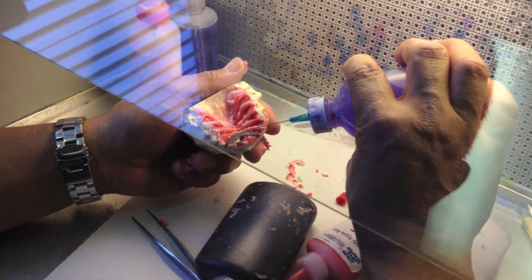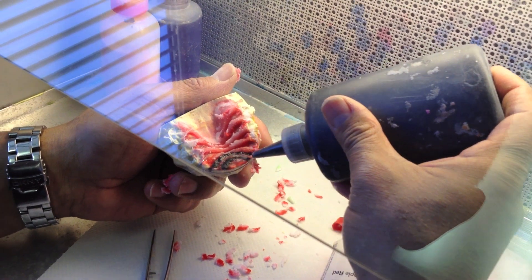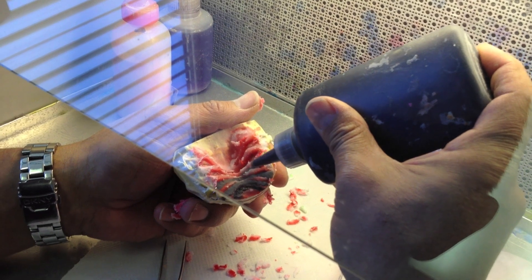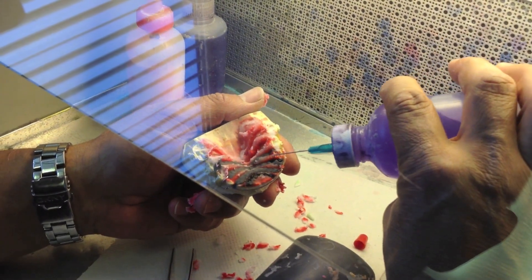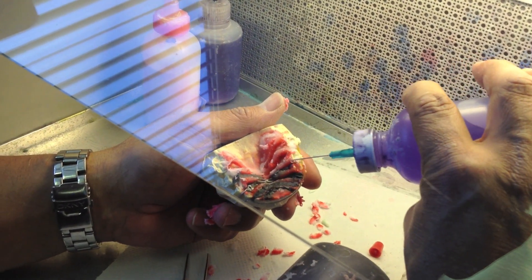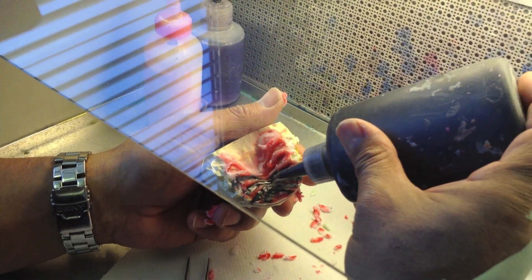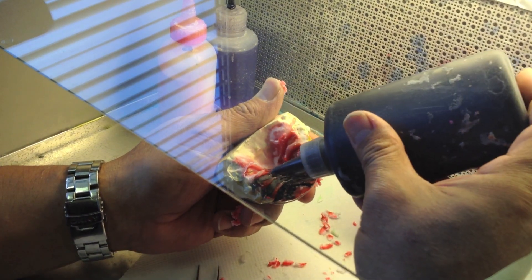He's adding the second color — notice he uses just real smooth motions, almost putting the tip into the trench to get smooth powder. Try not to trap any air bubbles using this method; you will trap some that you might have to repair, but just notice he's being real careful. Make sure the tips of your nozzles on your bottles are clean so you don't get any spraying on the sides.